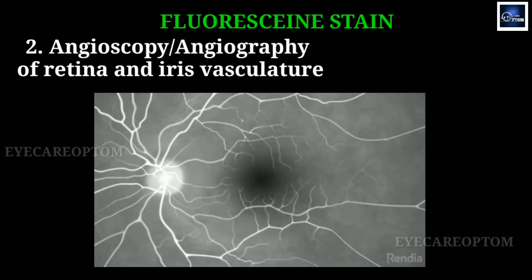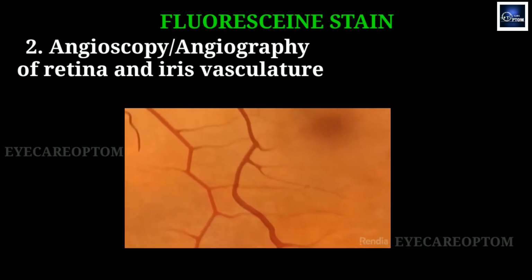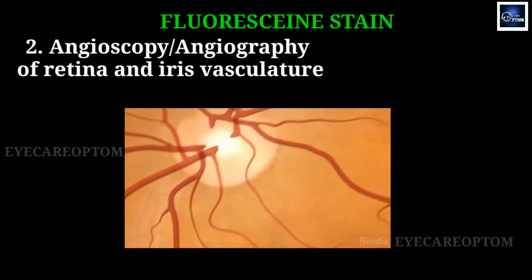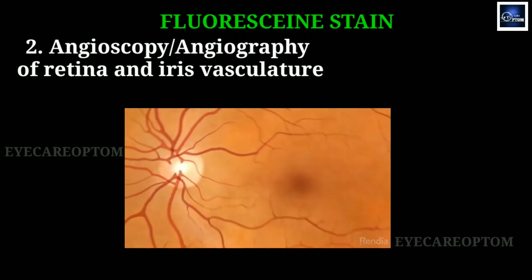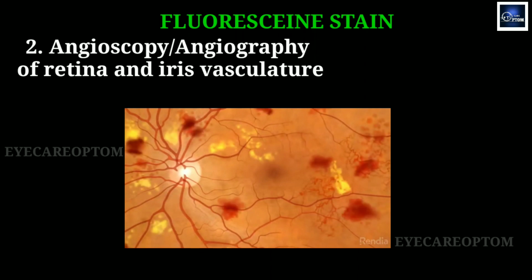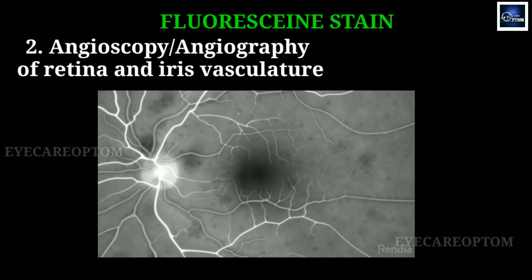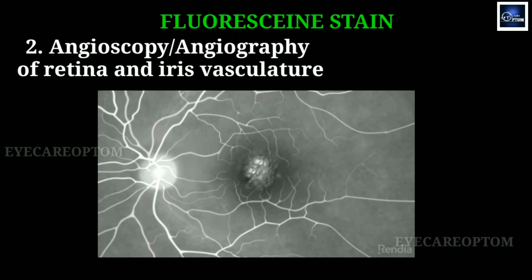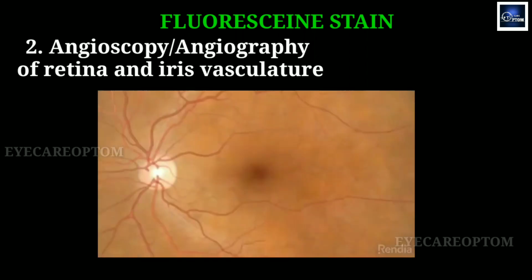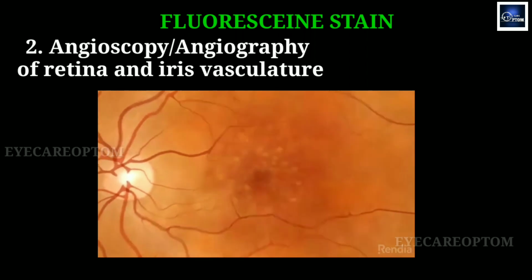Researchers are saying that retinopathy of prematurity relies on fluorescein angiography to evaluate the treatment efficacy between two drugs on peripheral retinal vasculature. Unlike plain photographs, fluorescein angiography will give us pinpoint measures in cases of vascular loop, blunting, dilatation, and capillary dropouts.